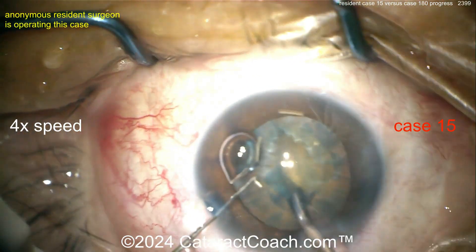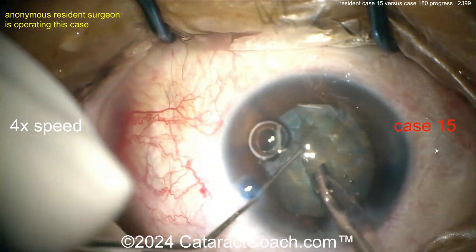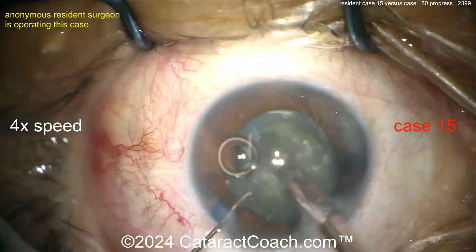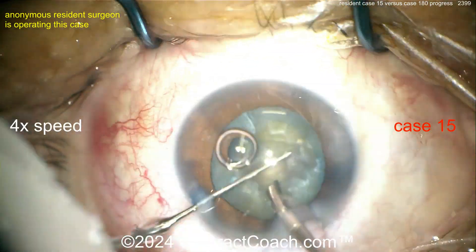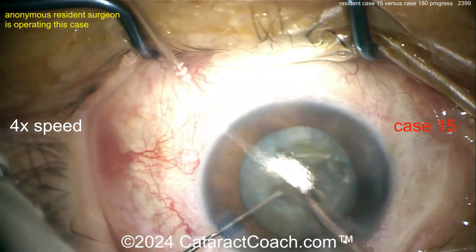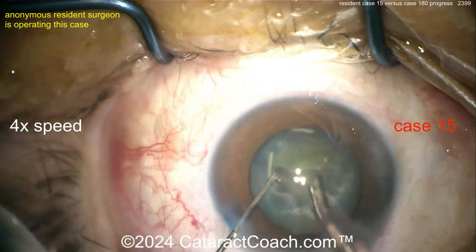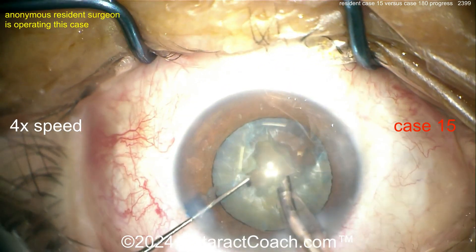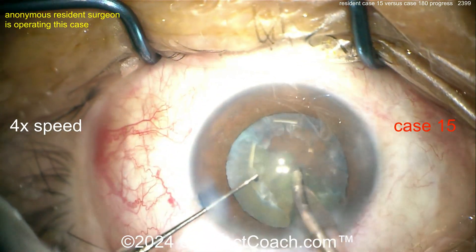Again, we've sped the video up. Groove down the middle — maybe a stop and chop, maybe divide and conquer. That's a reasonable groove — pretty good for case 15, actually really good for case 15. Not sure if that got all the way through. Taking the bubble out, and now groove — so divide and conquer. That looks pretty reasonable. Can you get a quadrant already? The surgical skill here for case 15 is great. I like how the eye stays in primary.